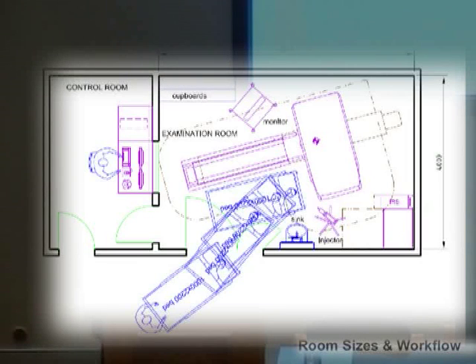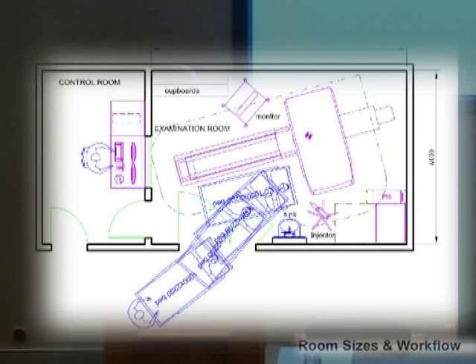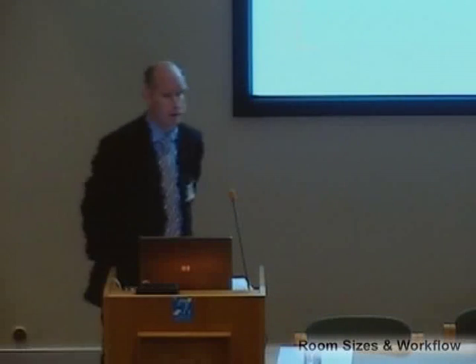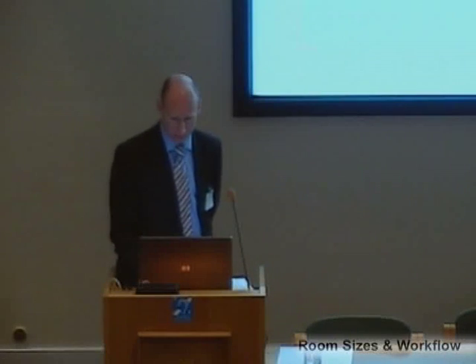The injector location is stuck where it is. It's a mobile injector, but because of the size of this room and the ancillary equipment that we've shown in there, it's almost impossible to move it out of that position. And the monitor, which would normally be on a monitor trolley, again, it's stuck. It can't get around the foot end of the table, and up by the gantry, you can't move it around there. So based on this 6 metres by 4 metres, you can categorically say it's not big enough. It's big enough for the equipment, but when you add the workflow scenario, it definitely isn't big enough. And this is just one example that gets overlooked, especially when we're designing rooms and hospitals.